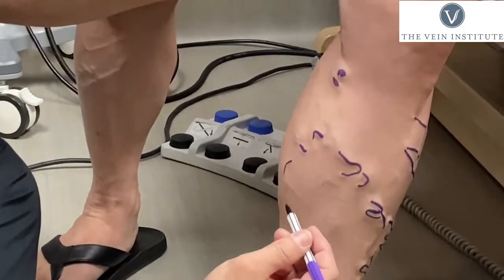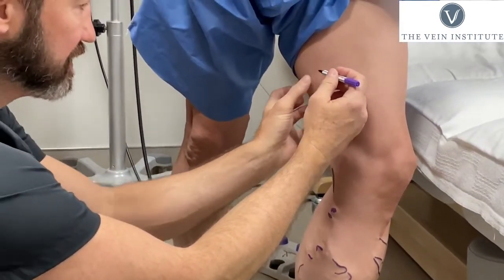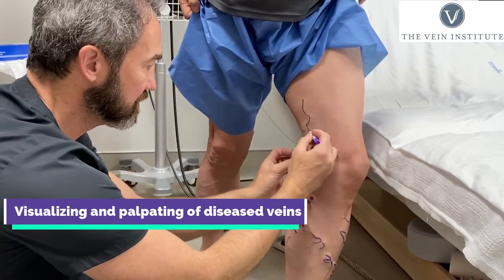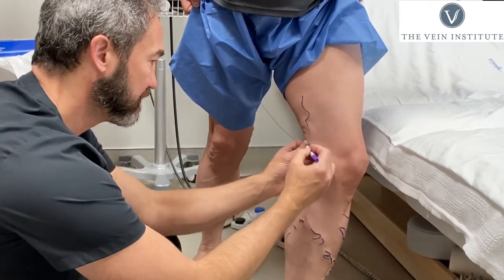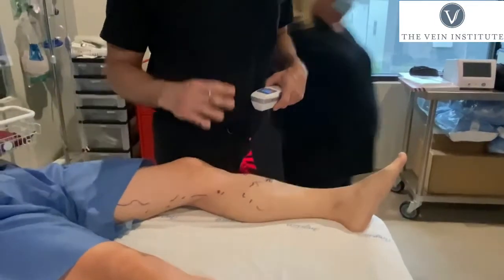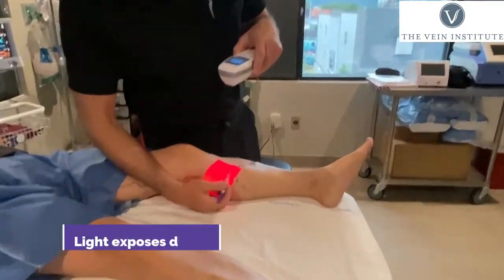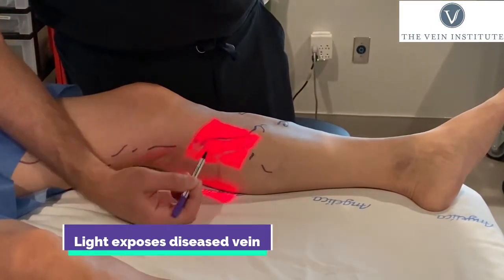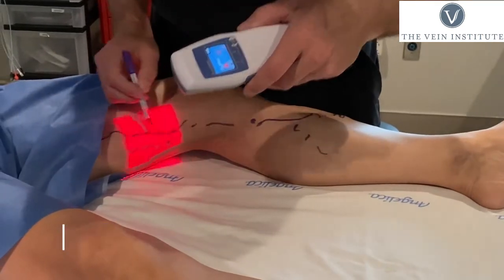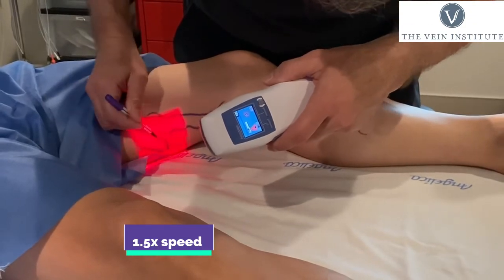You can see this big one right here comes all the way up. What we can see with him standing, with gravity helping distend the veins — now we're going to fill in the gaps by using this device that will help us show anything that we missed.